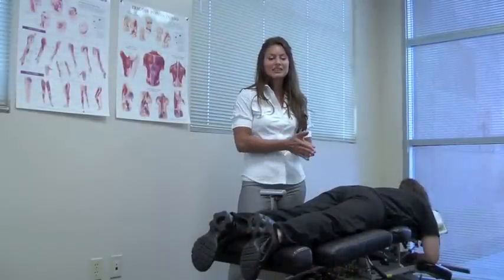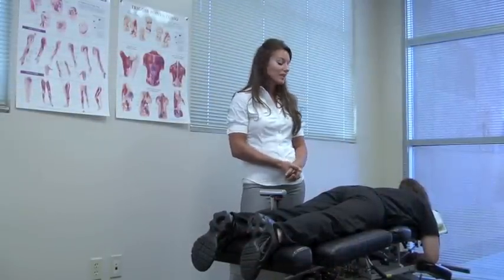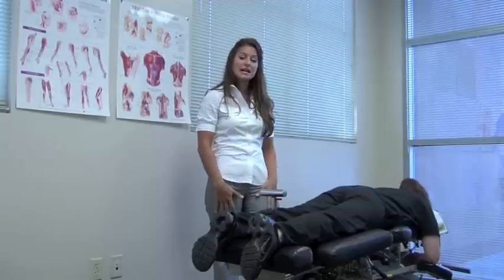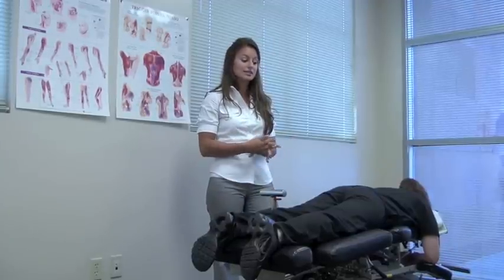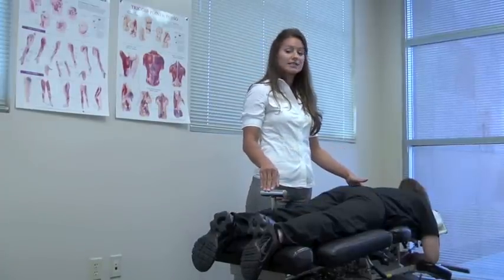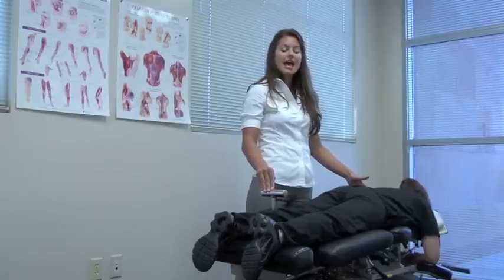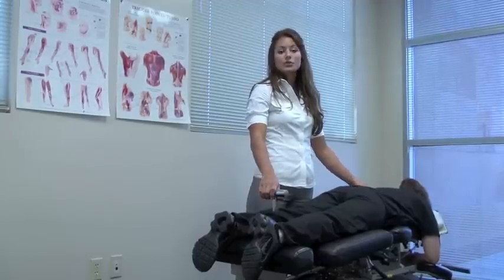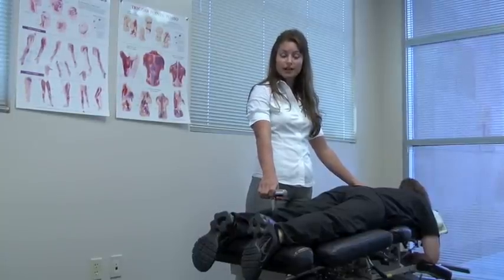So I know this can look a little bit intimidating, but our patient is very comfortable lying on the table. We can change the table setup based on those patients that may have a larger abdomen or for those patients that may be pregnant. So I'm going to be focusing on the region of the spine of the disc or nerve involvement. So I'll first add some tension to the spine, and then we'll stretch downward in order to lengthen the spine, moving that disc away from the nerve, just as we showed earlier on the model.